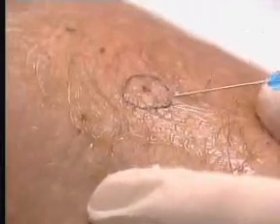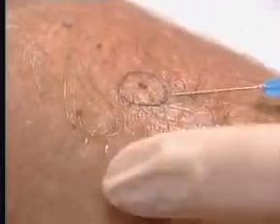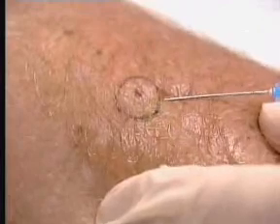Clean the area and apply a local anesthetic just around the mole. Once the area is frozen, pinch or pucker the skin to a small degree.